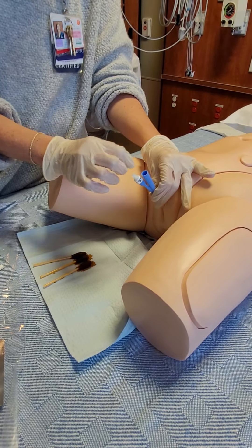What they'll do is start the contrast — the contrast will fill into the bladder. They'll take a bunch of pictures and then have the patient try and void. As the patient is voiding, they'll remove this and take several more pictures. It's a relatively short procedure if everything goes right; it's just about grabbing the right supplies and having it all ready.